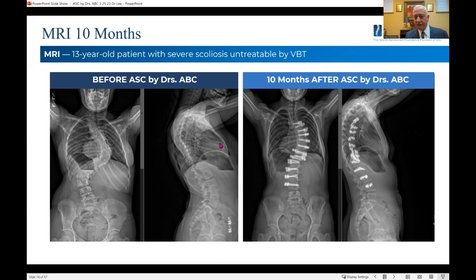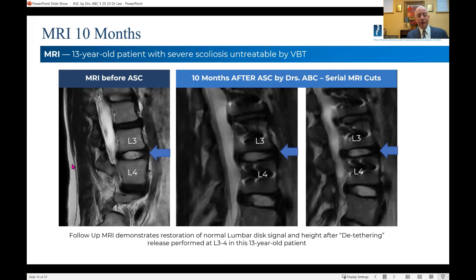Versus the results of the cord surgery — this was taken 10 months after the ASC. We also got the MRI from before the surgery and MRI after about 10 months. Very clearly, you can see this MRI before shows a nice signal in the disc space at L3-4. This is a level that I released — and it's not a thoracic level I'm showing, it's a lumbar level.